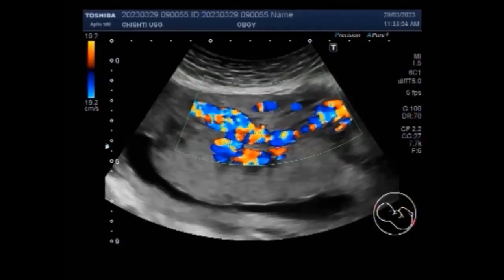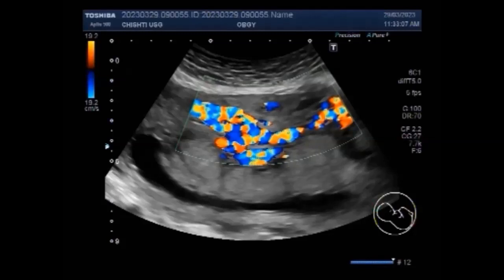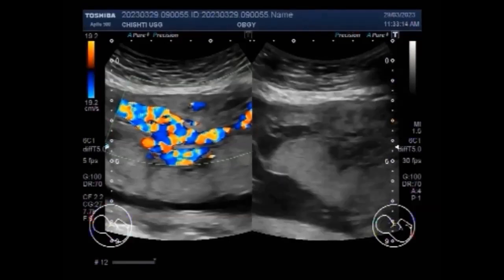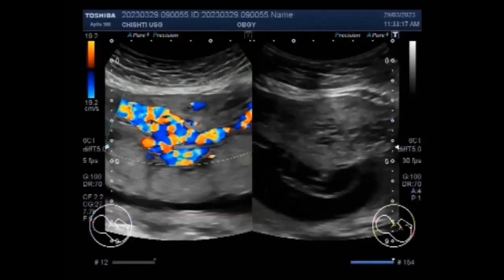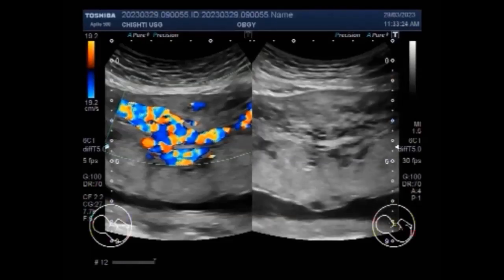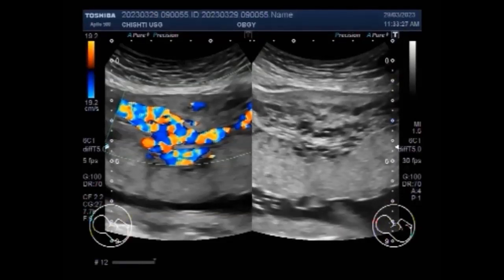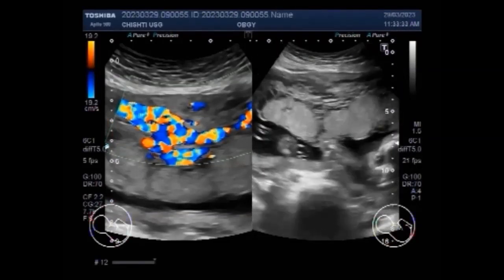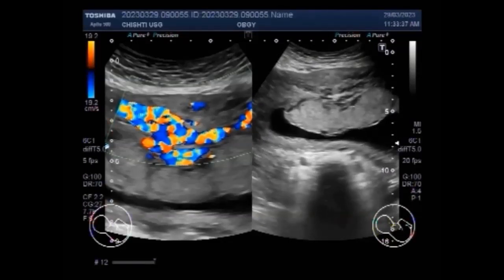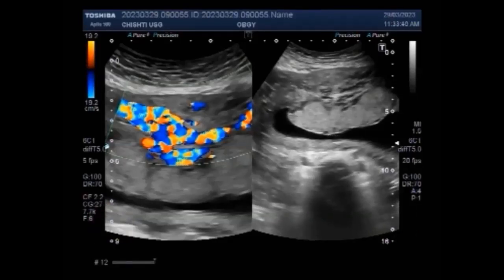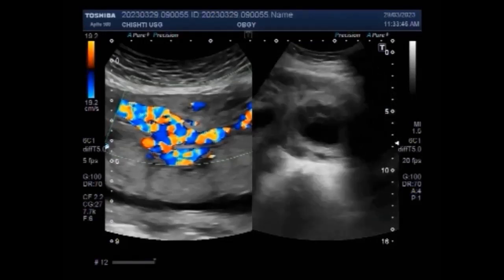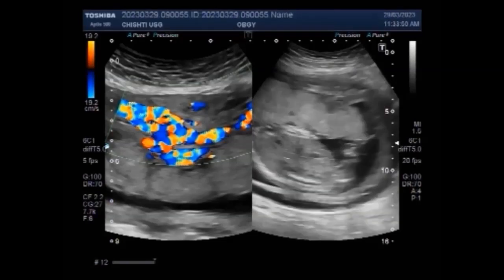For choriocarcinoma, the risk is lower below the age of 25 and then increases with age until menopause. You can see a significant blood flow in the hydatidiform mole. Hydatidiform moles should be taken as pre-malignant lesions because 15 to 20% of complete hydatidiform moles and 1% of partial hydatidiform moles undergo malignant transformation into invasive moles, choriocarcinoma, or in rare cases placental site trophoblast tumors.